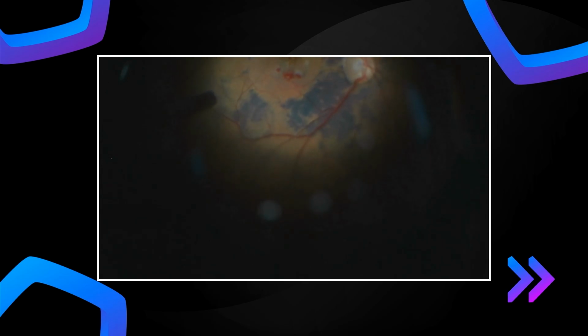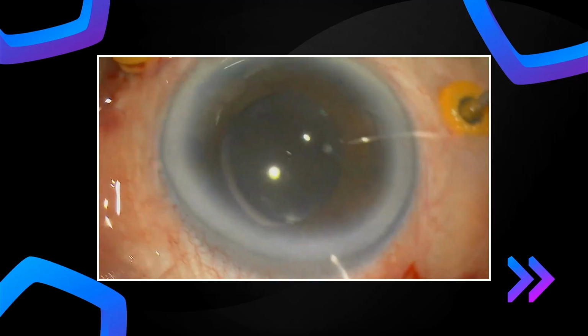After that, we do the air fluid exchange. After doing the air fluid exchange, we inject the autologous plasma at the macular hole.